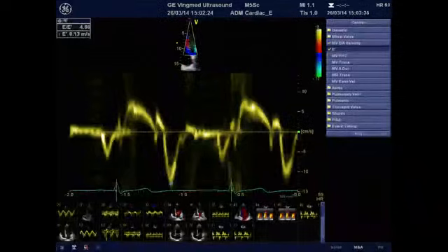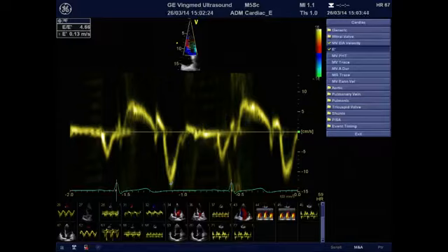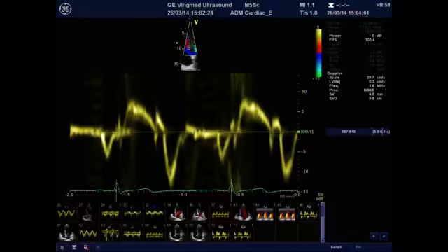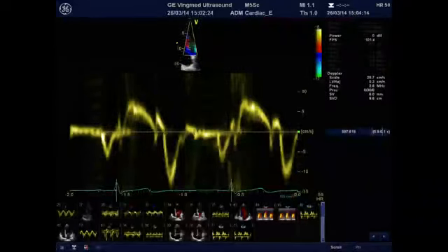And you see, since we have also recorded the E wave, the machine already displays the ratio between the E over E prime, which is an important parameter, and I will get back to that when we discuss the combination of the parameters. So it is important to record it in the right way by placing the sample volume in the right position, by carefully adjusting the settings related to the gain and to the wall reject in order to get crisp waves recorded of the profile, and then one can really measure easily the peak velocities of both E prime and A prime.